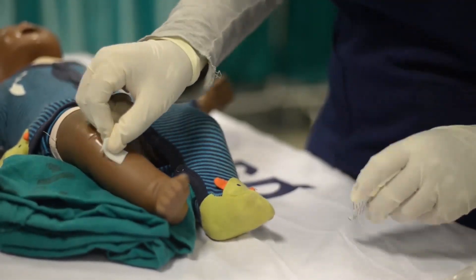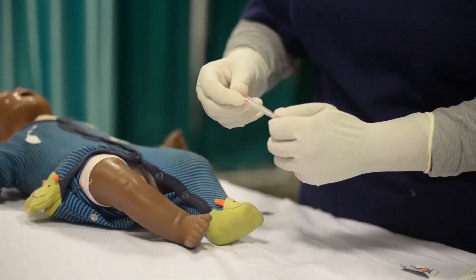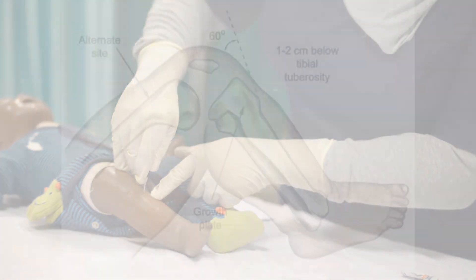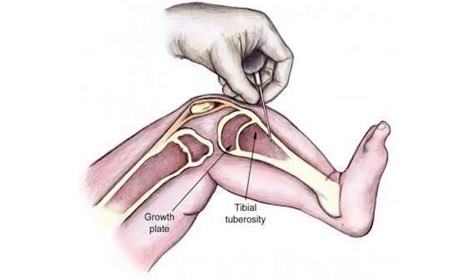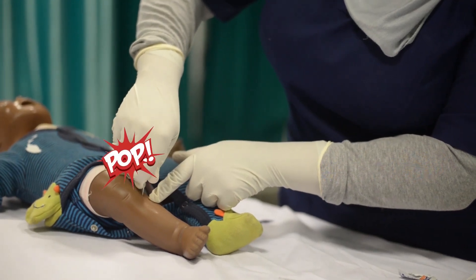Prepare the site with povidone solution. Inject lignocaine for local anesthesia. Hold the blood-giving set needle with the palm of your hand and place your index finger on the shaft. Insert it firmly through the skin onto the tibia. The alignment of the needle, wrist, and elbow in a straight line gives the operator better control of the needle while increasing strength. Use the screwing technique to insert the needle into the shaft until you hear a popping sound.